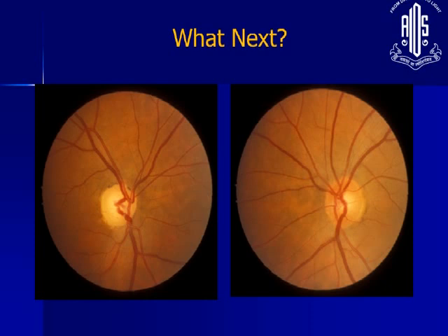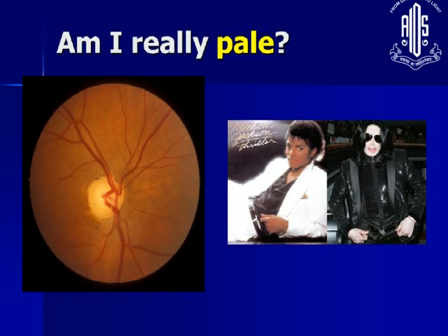You count the number of capillaries on slit lamp. If the number of surface capillaries is less than 6, you are looking at probably optic atrophy. If the number is more than 12, you're looking at a hyperemic disc. The 10 is what is considered a normal number. So that's the Kestenbaum capillary number. Right.